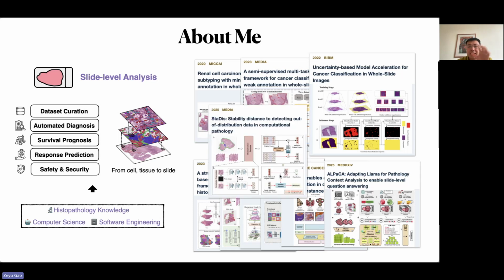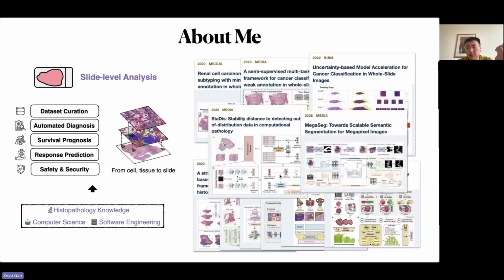As a side project, we focus on out-of-distribution detection in computational pathology, because we have a lot of foundation models that are all trained on specific datasets. They are said to be general, but sometimes you still have some outliers. How do we detect those outliers? We have this model, and most of these days they focus on slide-level classification or patch-level classification.